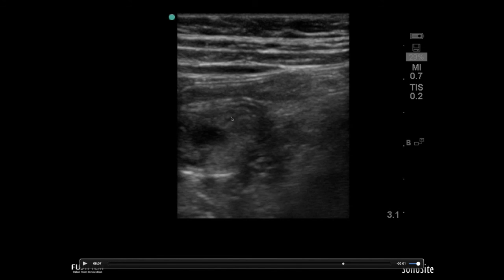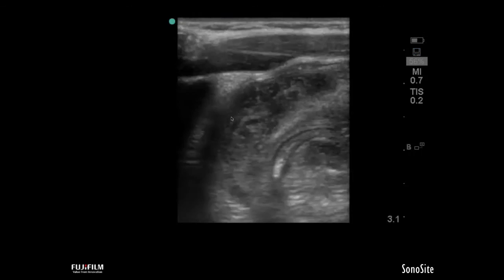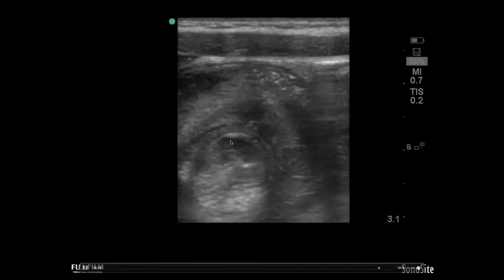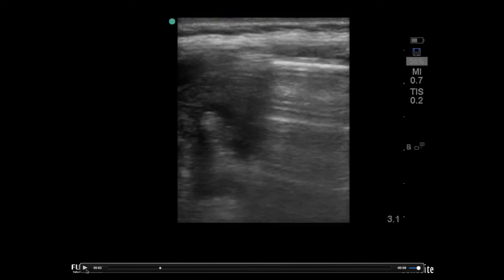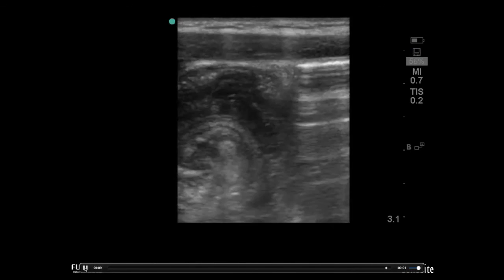After just a little bit of instruction, I'm going to show you a video — see if you can identify normal or abnormal and whether you see ileocolic intussusception. Let this video run, identify what you're looking for — and right there, that's the ileocolic intussusception. There are a couple of interesting things that appear here. Those hyperechoic lines represent a normal section. And right in the corner up on top of the screen, we can see a little glimpse of gallbladder — that tells me I'm in the right upper quadrant. Right here we see that targetoid cinnamon roll appearance — that's the ileocolic intussusception.